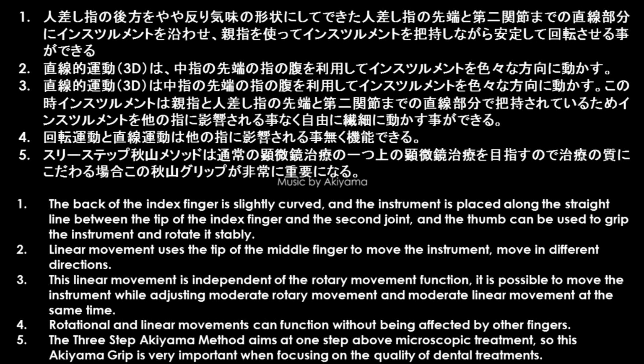Four, rotational and linear movements can function without being affected by other fingers. Five, the three-step Akiyama method aims at one step above microscopic treatment, so this Akiyama grip is very important when focusing on the quality of dental treatments.